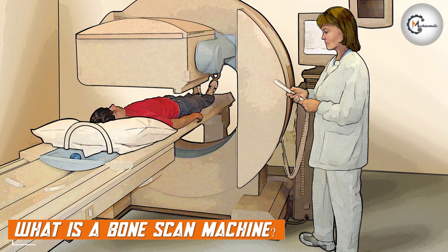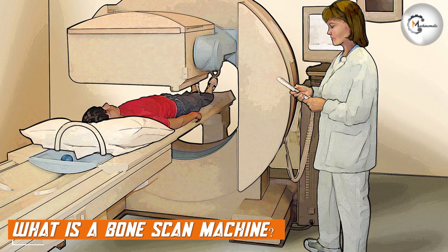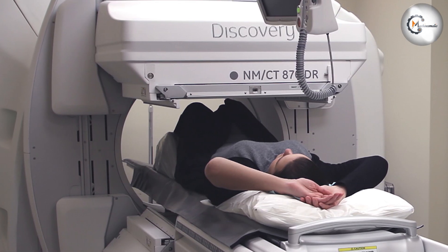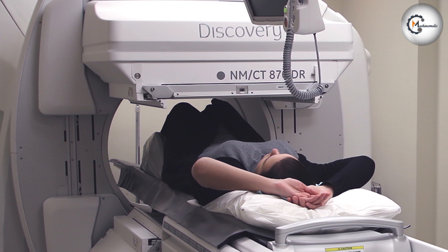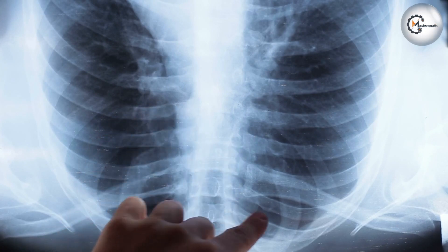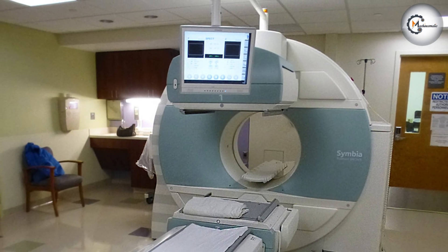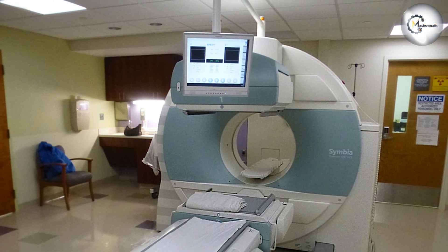Bone scan machine, also known as bone scintigraphy, is a nuclear imaging test that is used to diagnose bone-related conditions such as cancer, infection, and bone injuries. In this procedure, a small amount of radioactive material is injected into the bloodstream, and a special camera is used to take images of the bones. The camera detects the radioactive material in the bones, which helps doctors to identify any abnormalities.